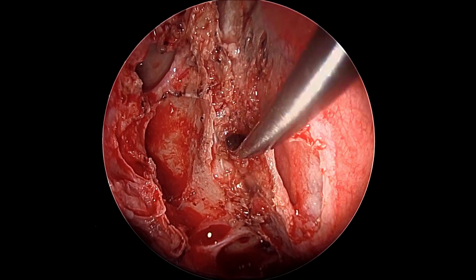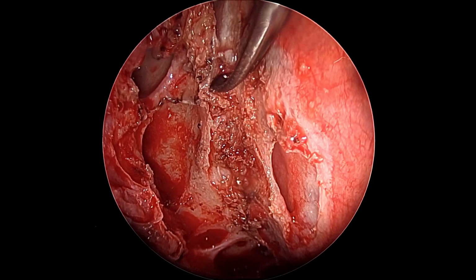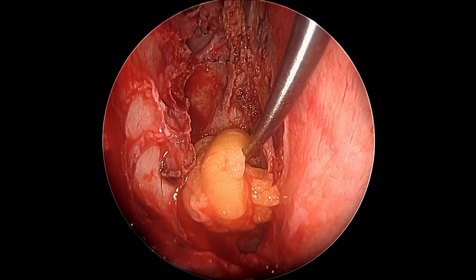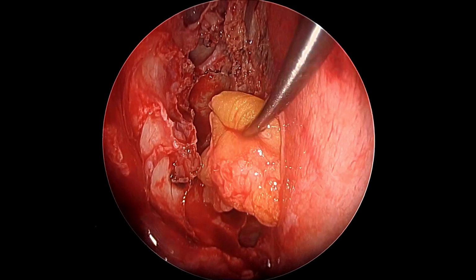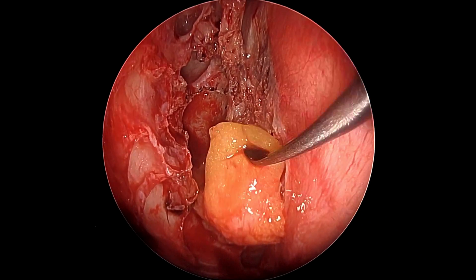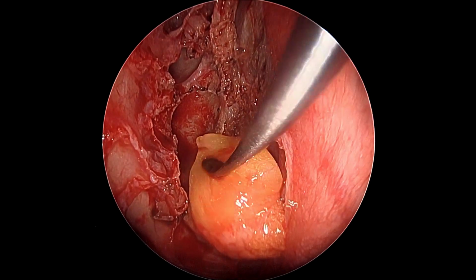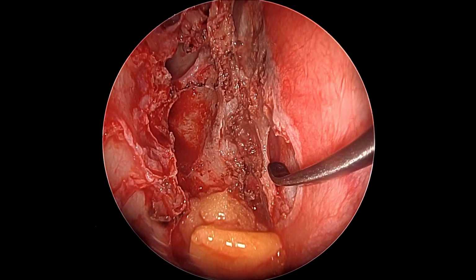Towards the septum, if one really has to do it, then one has to do a superior septectomy, and that is the only way we can do this step, because the dura gets attached to the crista galli. So here we use some fat harvested from the thigh as the primary graft material. As we see, we are still working with the 70-degree scope all this while. It gives us a good vision.